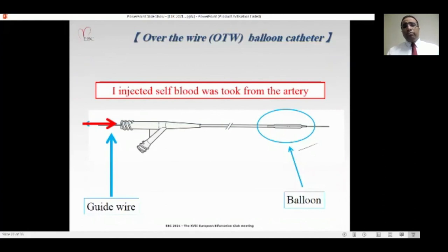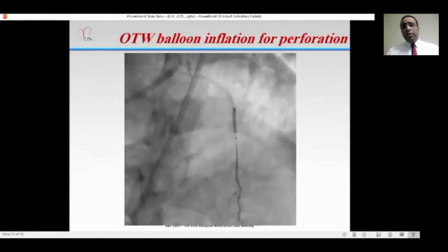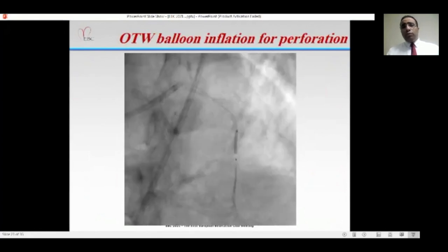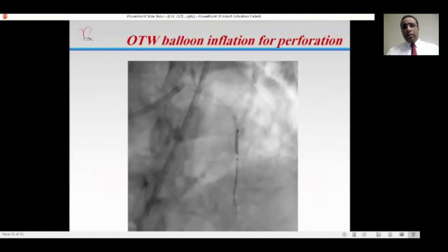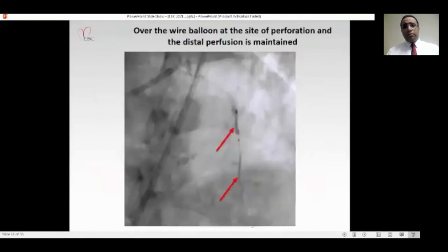So I am maintaining distal perfusion of the rest of the myocardium. After injection of self-blood, the ST-segment elevation decreased and the chest pain of the patient disappeared. I maintained the inflation for 20 to 25 minutes continuously, with continuous injection of self-blood. Here, as we see, the over-the-wire balloon is at the site of perforation, and distal perfusion is maintained.